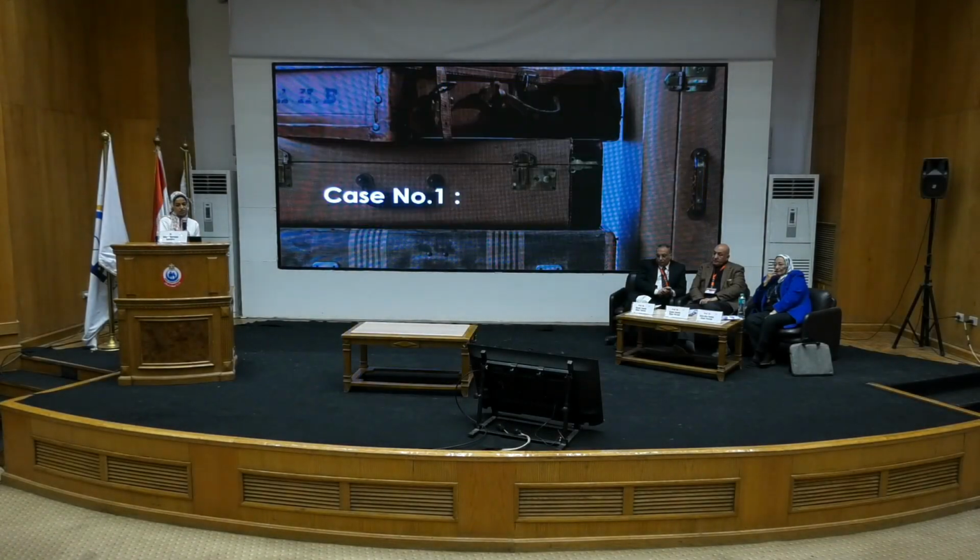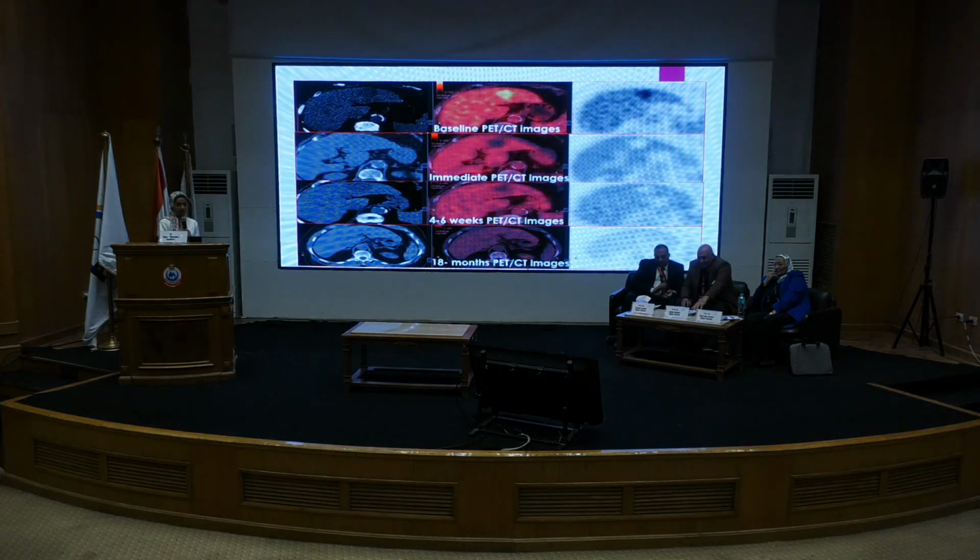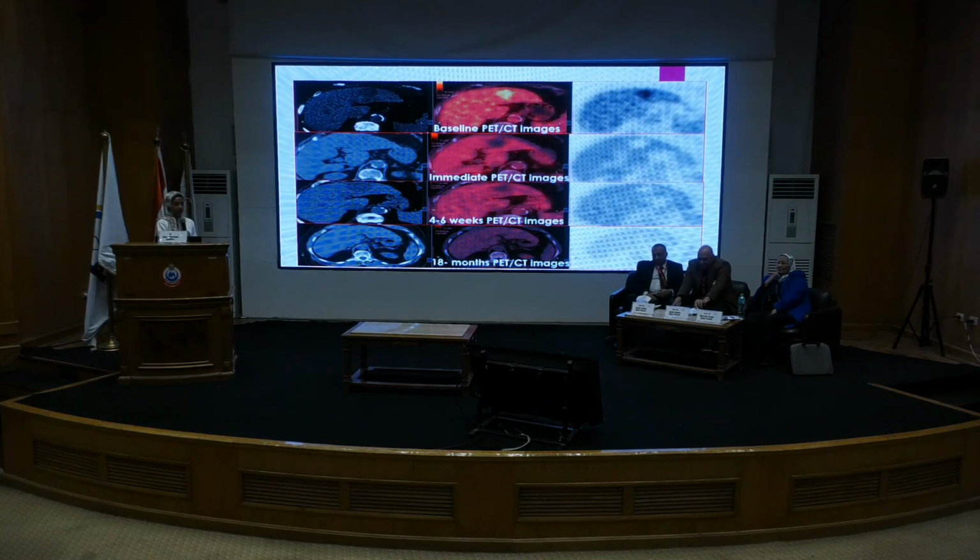Case presentations. We have case number 1. This patient had an active hepatic focal lesion at the left lobe. Immediately after the RF, these are the immediate images.